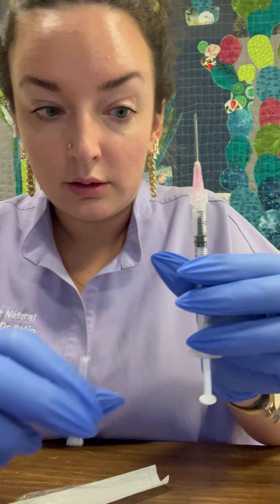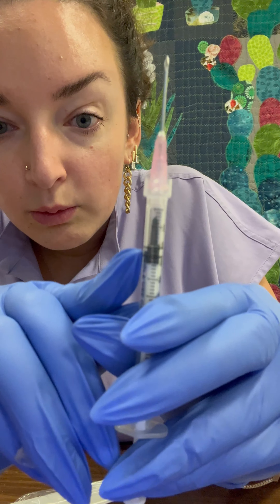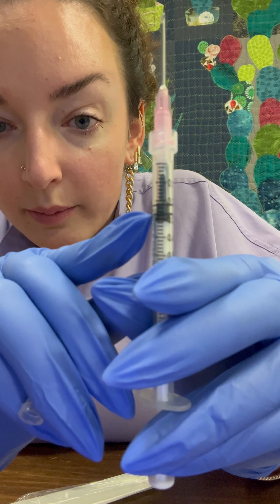Once you're done, let's say your dosage is at 0.2 — you're measuring with this top black line, not this bottom one. This top, not the bottom.